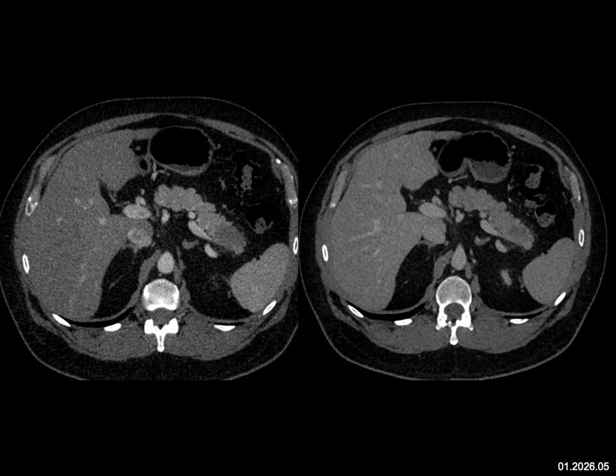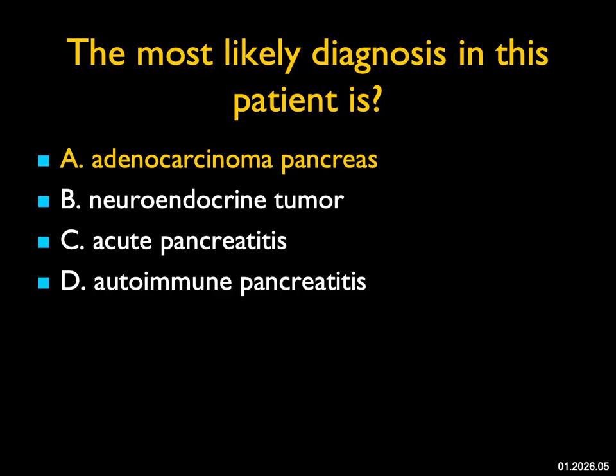On the arterial and venous phase imaging I don't see vessel invasion or liver metastases. This patient should do very well with a distal pancreatectomy.